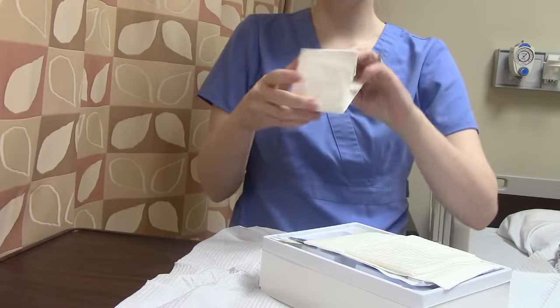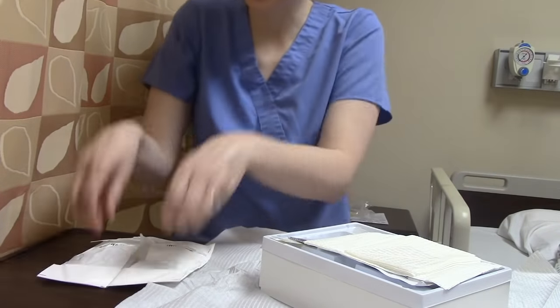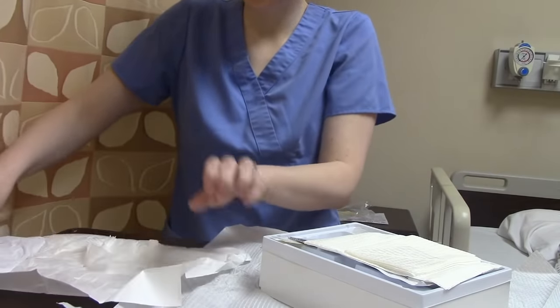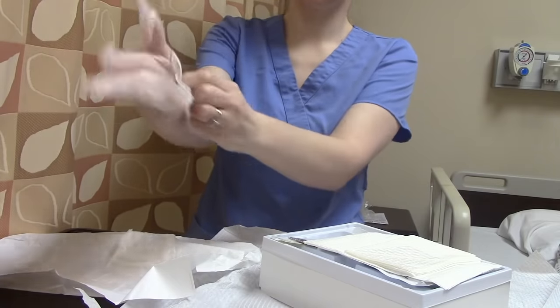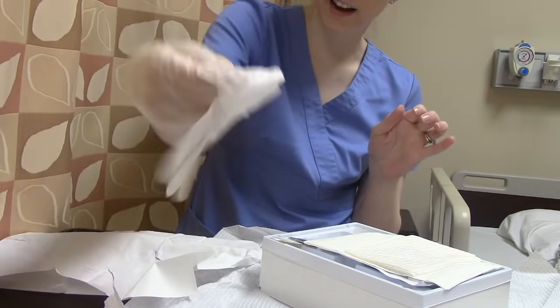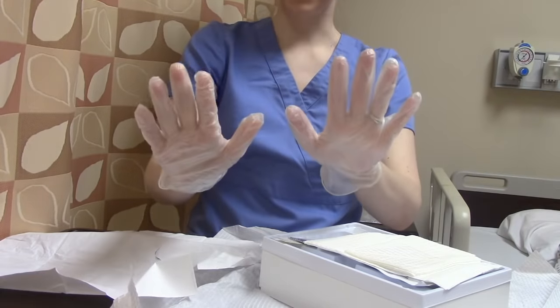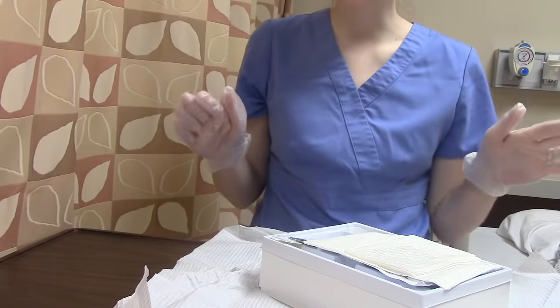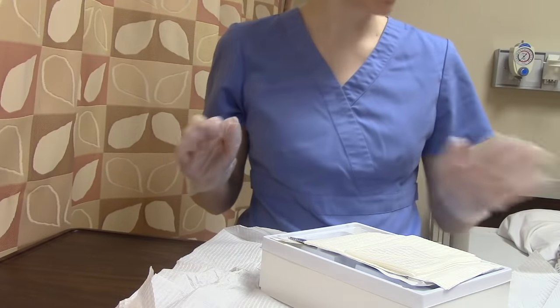We'll take our sterile gloves and open them without touching the outside — only touching the bottom. To put on the second glove, sneak your fingers in under the cuff so you're not touching anything. Now we have our sterile gloves on. I highly recommend getting all your supplies ready now so you don't find yourself in a situation where your non-dominant hand is contaminated and you're stuck using only one hand.